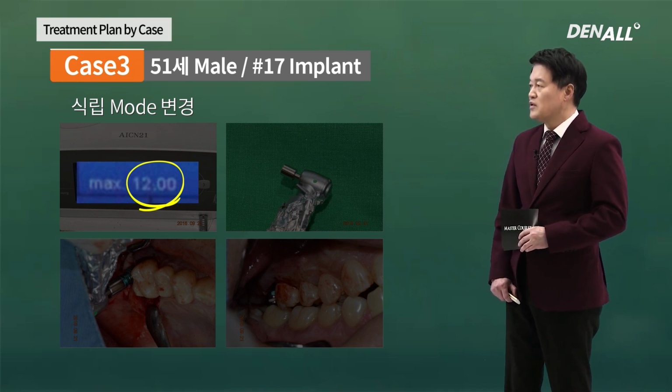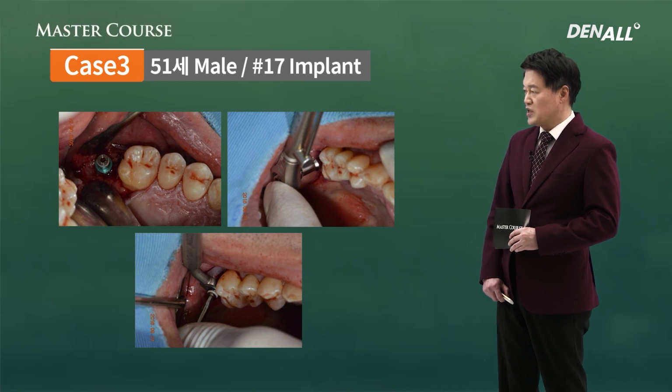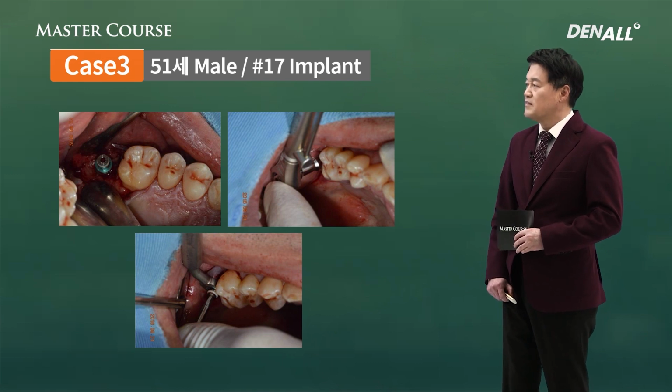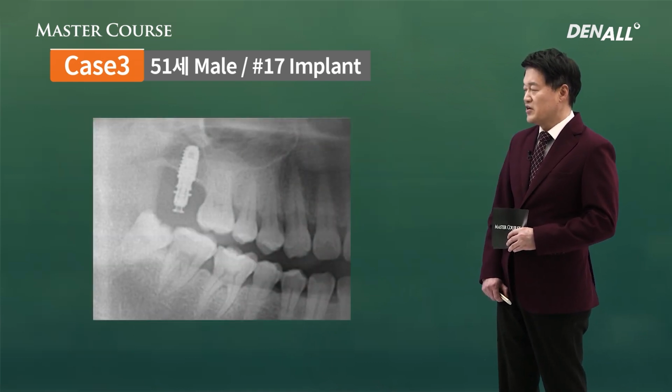I did additional depth control, and finally I removed the mount. I used an open wrench because initial stability was insufficient, and I held it and then removed the mount. X-ray was taken. I checked.